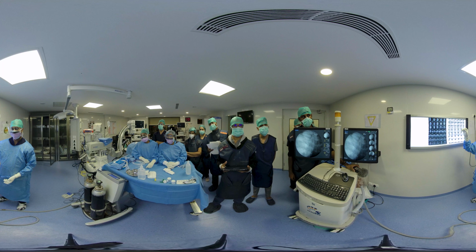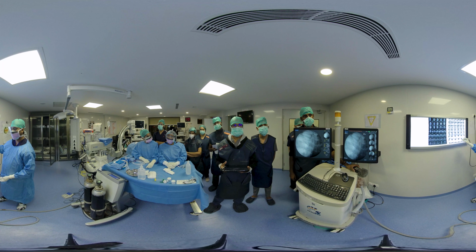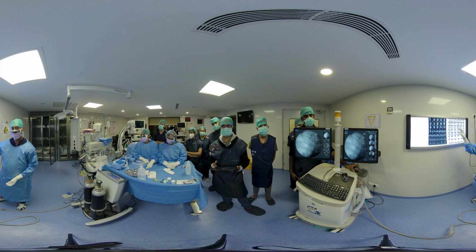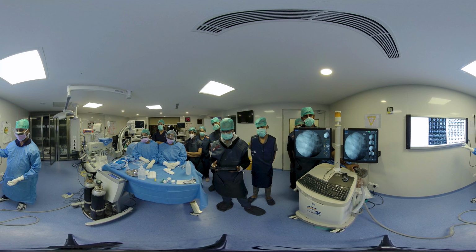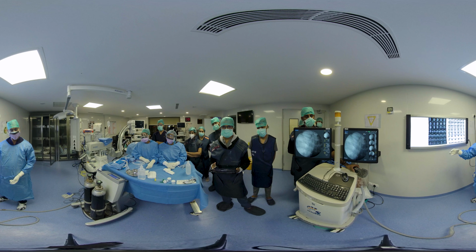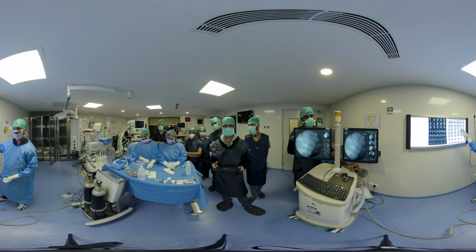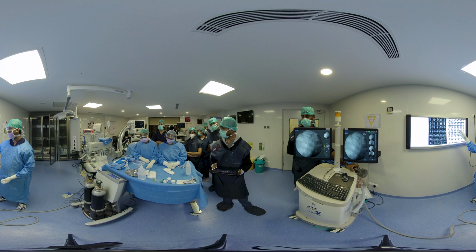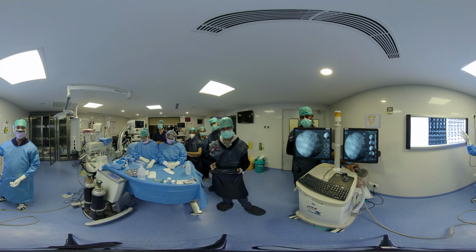And generally the cryo gives a better yield than the forceps, so today we are going to attempt a radial EBUS with a cryolung biopsy. This would have been an ideal candidate for a concurrent staging EBUS, but since there were some adrenal mets, the stage is already stage 4. So we will be going ahead with a rigid bronchoscopy and radial EBUS and cryobiopsy using a 1.1 millimeter cryoprobe. So let's see how we do it.